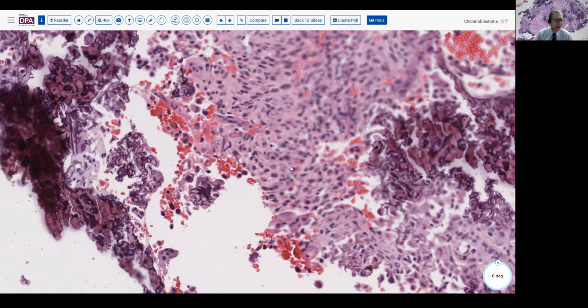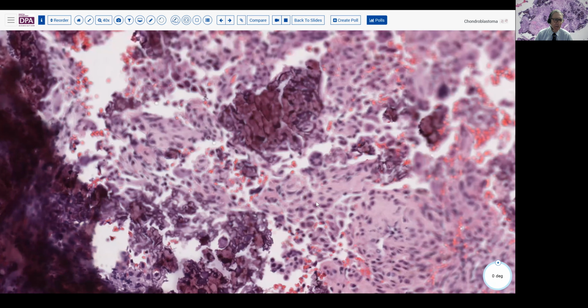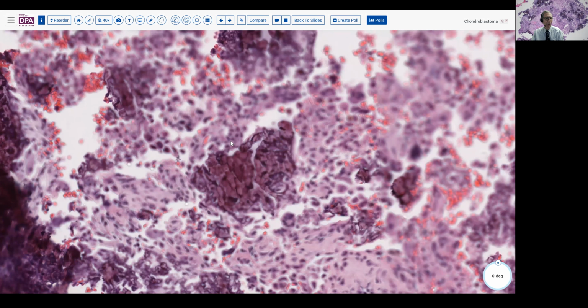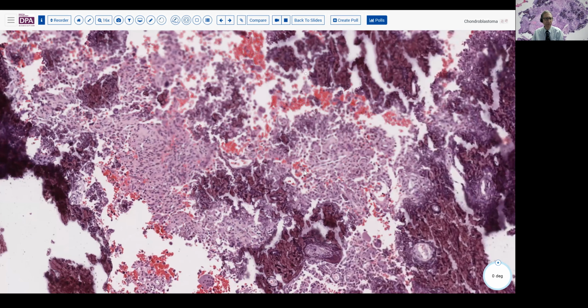And in fact, in a skeletally immature person, such as our patient today, a lesion in the epiphysis in that age group, skeletally not yet fused, is virtually always going to be a chondroblastoma. In a skeletally mature person, of course, you can have chondroblastoma, you can have giant cell tumor, you can have other lesions that can have that appearance and those sorts of radiographic features.